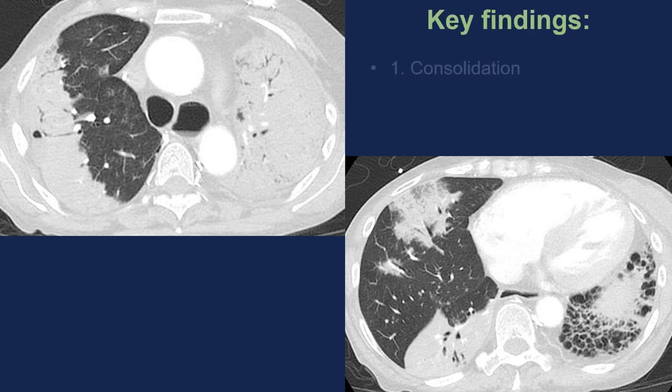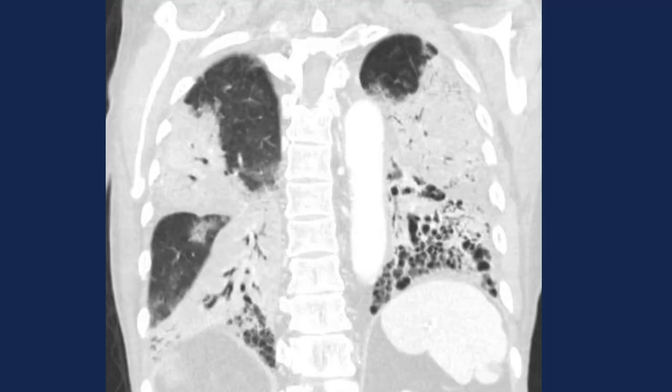The key findings in this case are consolidation as the main finding and some cystic lucencies, which were initially thought to be due to interstitial lung disease — she was on steroids for this interstitial lung disease. The coronal image demonstrates the cystic lucencies at the bases to better advantage, confirming all of the other findings.